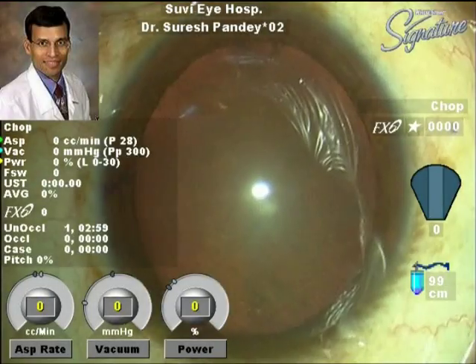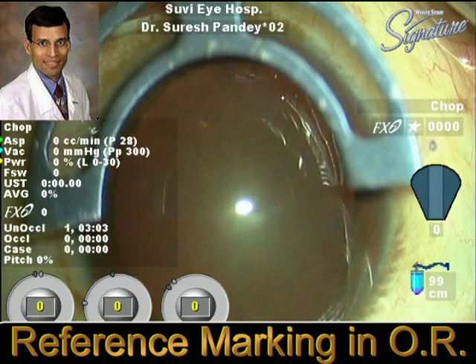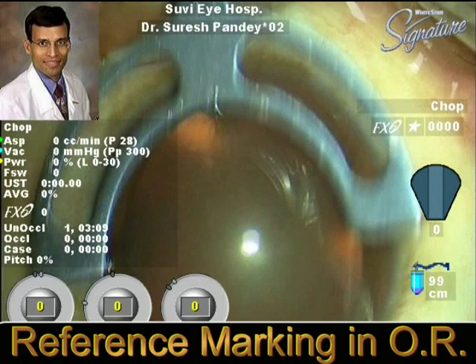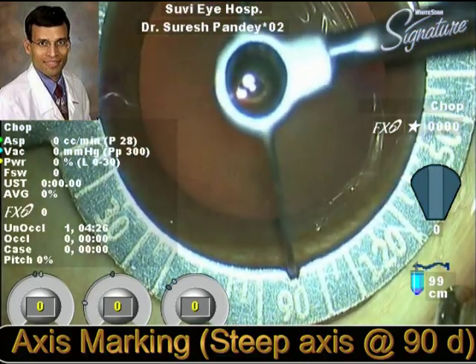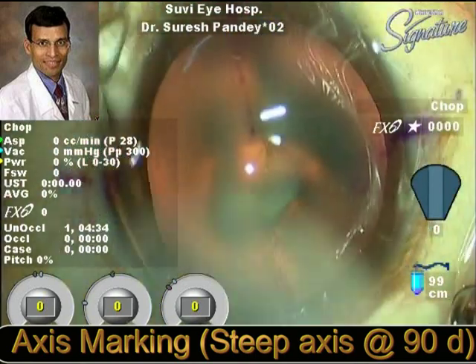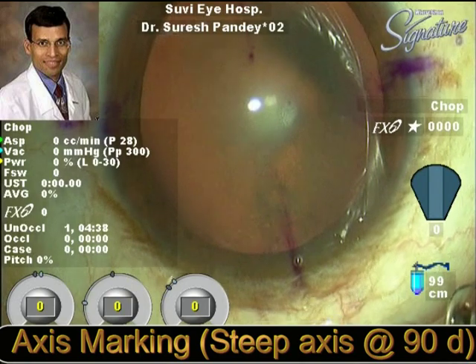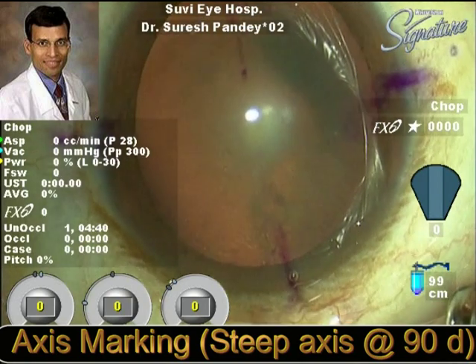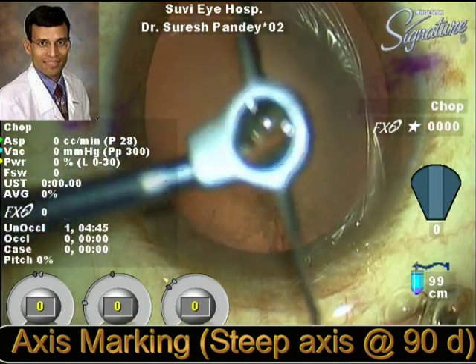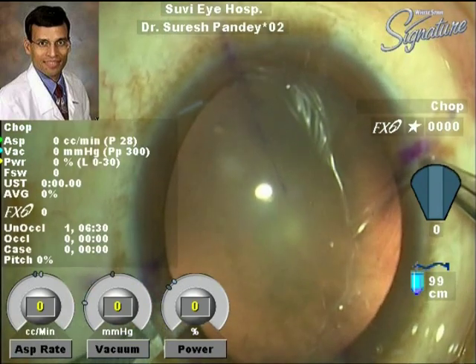On the operation theater table, the reference marker is applied again along the same marks and the axis is being marked. We must be very careful to make these axis marks as thin as possible, otherwise thick marks can introduce a few degrees of error. As you can see here, these axis marks are very thin.